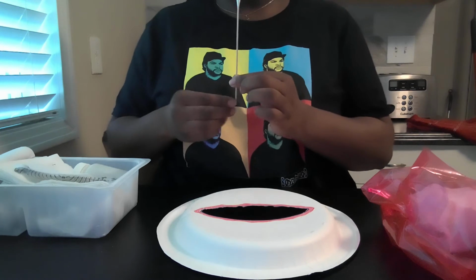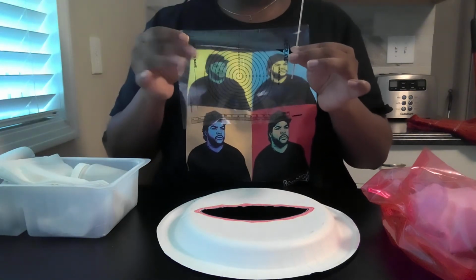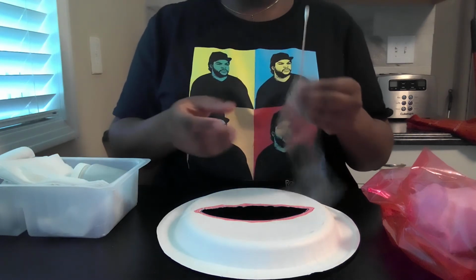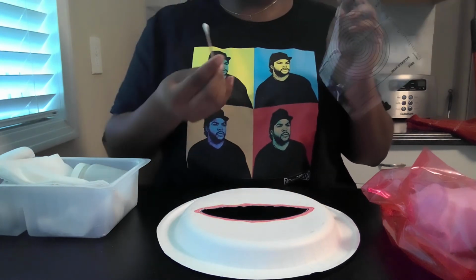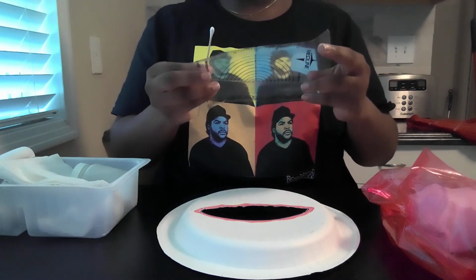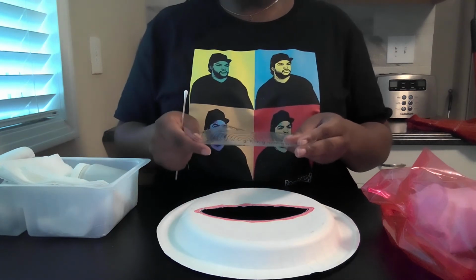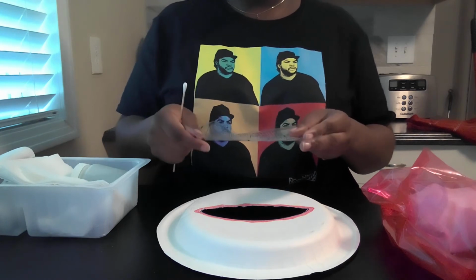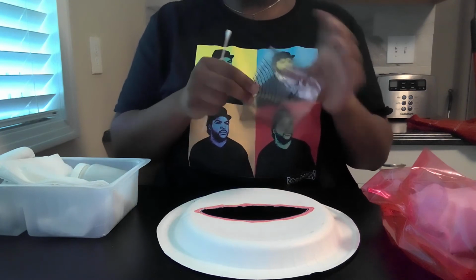What I'm going to do is take this, and I'm also going to take some clear, transparent ruler sheet that's within the packaging. You can take this and actually measure the wound, and you can also measure the depth of the wound with this applicator. Also, in the future you can look to see if the wound is healing, because you can check whether the wound has decreased in size based upon your last measurement.